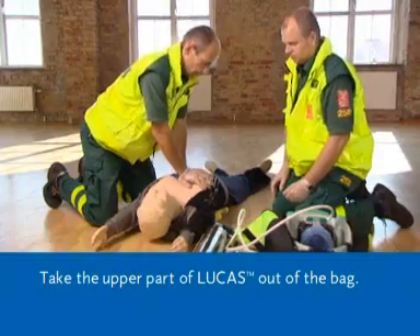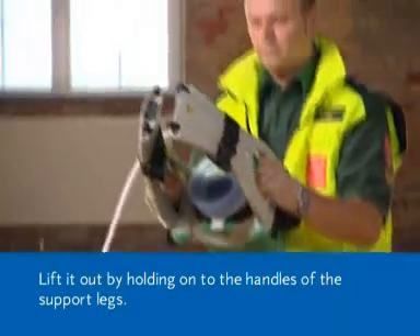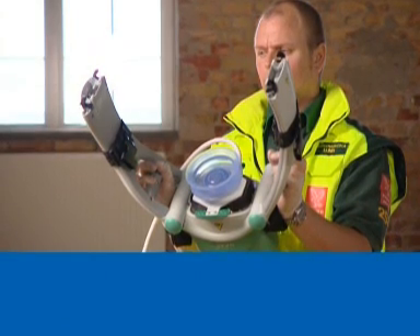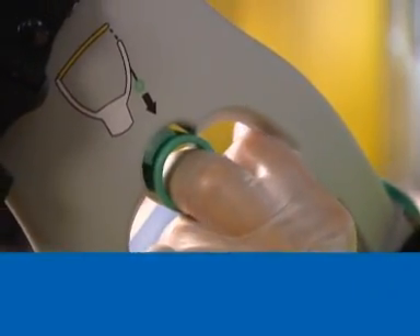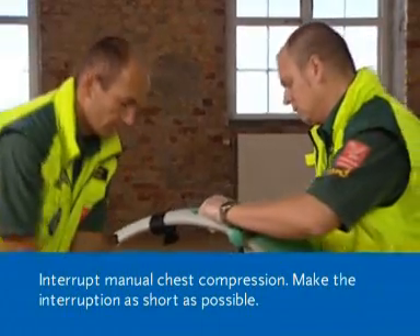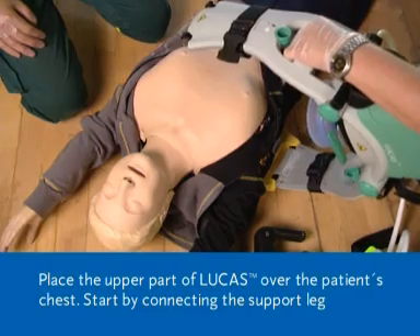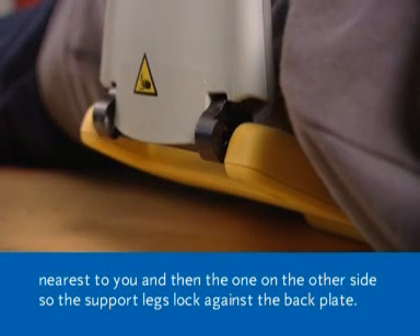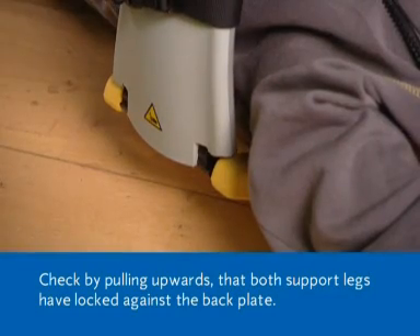Take the upper part of Lucas out of the bag. Lift it out by holding on to the handles of the support legs. Ensure that the support legs have reached their outer position. Pull up once on the release rings to check that the claw locks are open. Interrupt manual chest compression — make the interruption as short as possible. Place the upper part of Lucas over the patient's chest. Start by connecting the support leg nearest to you and then the one on the other side so the support legs lock against the back plate. Check by pulling upwards that both support legs have locked against the back plate.